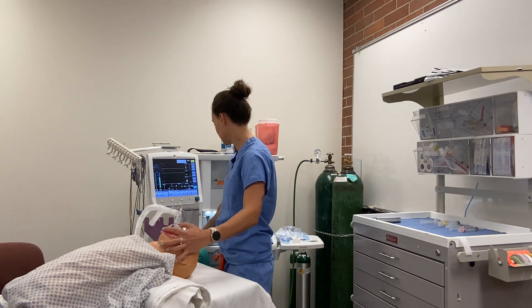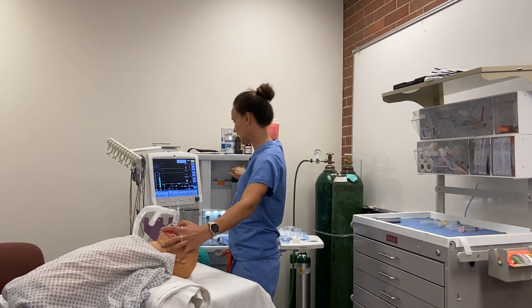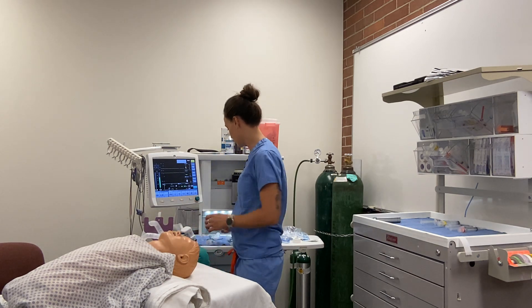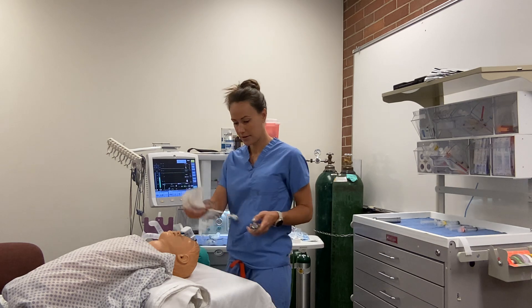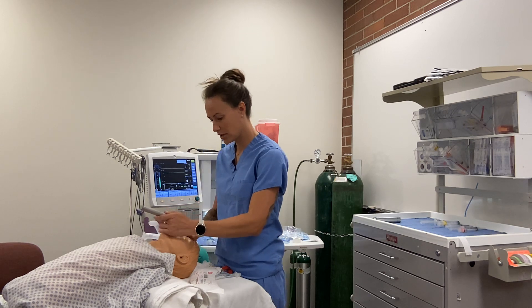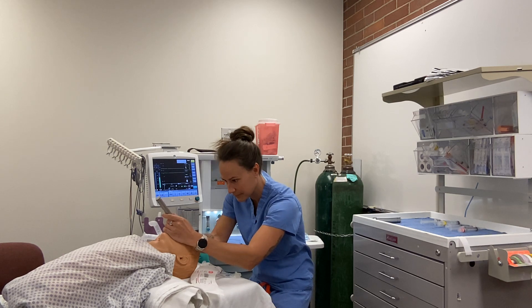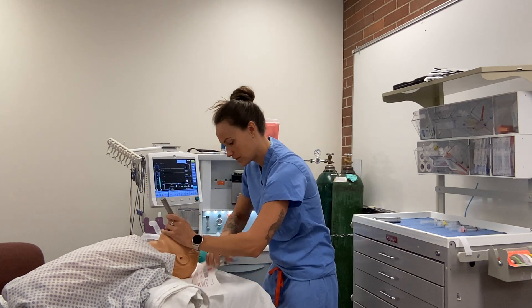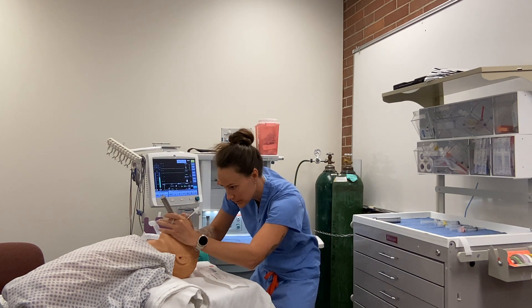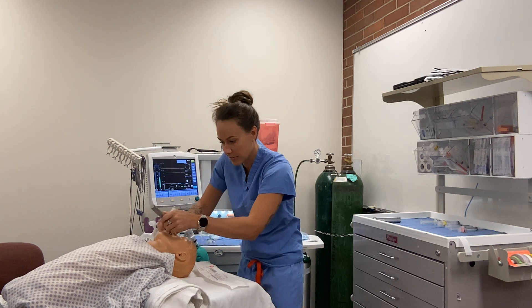Meds are in and the patient is asleep. We turn off our gas and nitrous so we don't gas the room, and we get ready to intubate. I'm going to use the Miller blade — it offers a little less tongue control but allows you to lift the epiglottis directly. I visualize the cords and pass the tube through the cords to a depth of 15 cm.